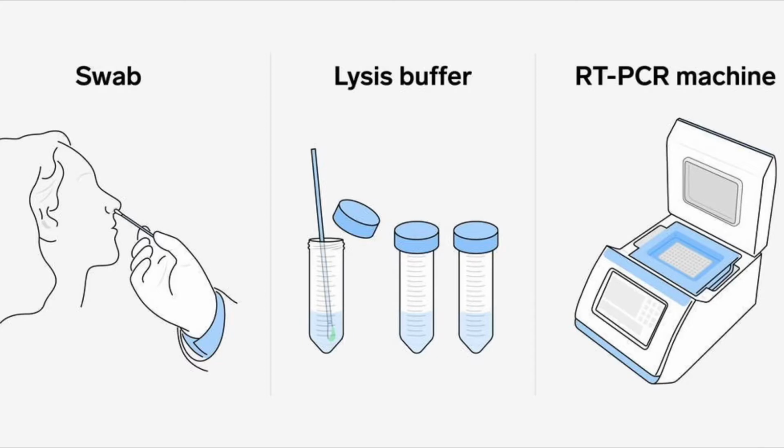So, PCR or RT-PCR consists of three main steps. Obviously, the sample needs to be obtained from the patient using a swab that is mostly done through the nose or through the pharynx. There's another way, which is endotracheal aspiration, which is used less commonly but gives us a more specific and sensitive result.